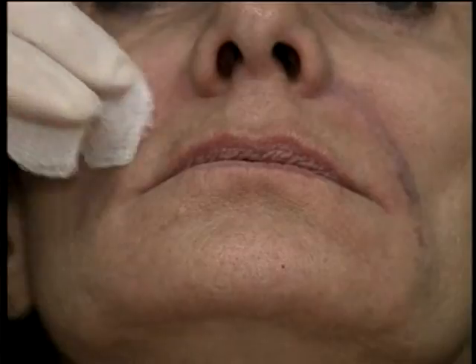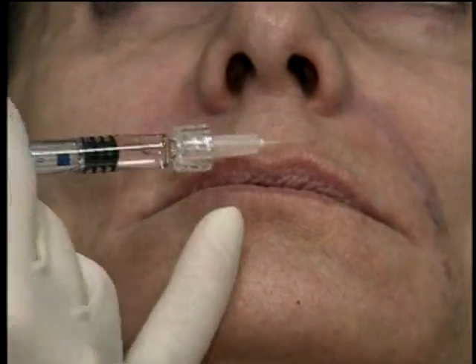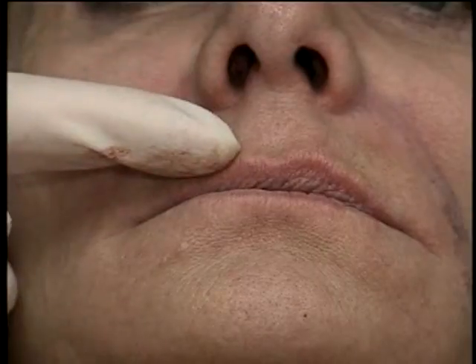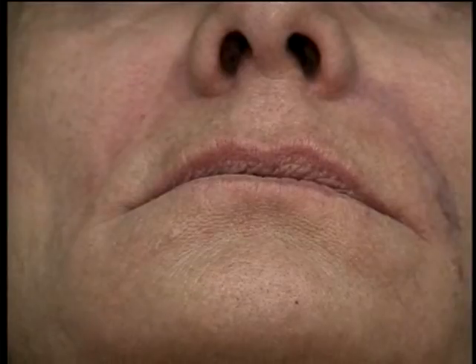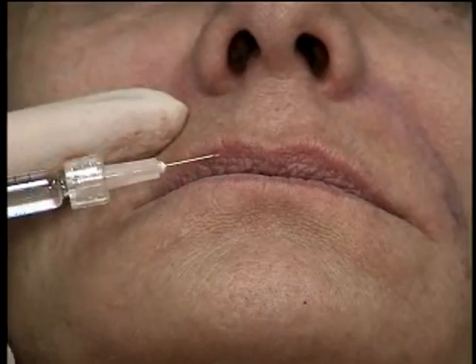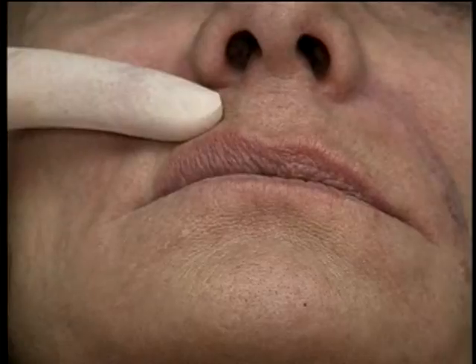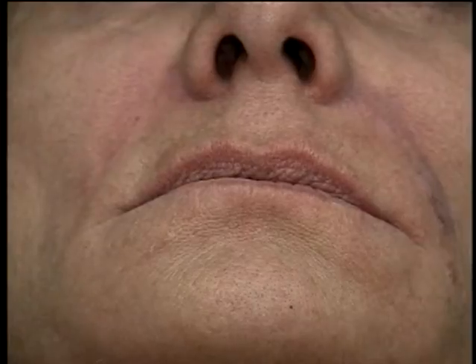Now in treating the lips, there's a few different tips here. If you look at her lips, she's got nice lips. She's got a vermilion border that you can see. She has some fine lines encroaching on her vermilion. She has some lip body, but she's clearly had some of the effects of aging as her upper lip is thinned. There are those who have a very thin upper lip, and there's very little red show, and in such a case, it's quite difficult to give them additional red show. But someone who already has some red show of their lip, I mean by red show, the red vermilion, I can do some things to bring that up. So with her, I'm going to show you some tricks I have for increasing the amount of red show on that vermilion.